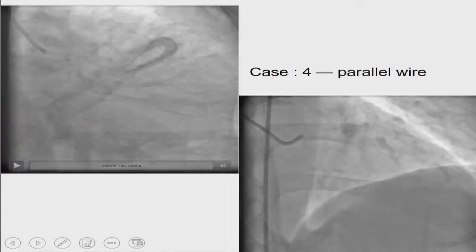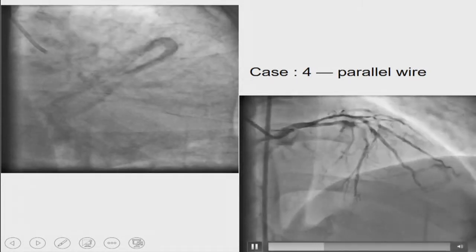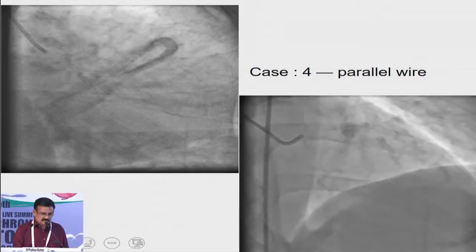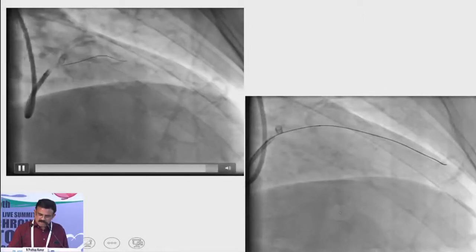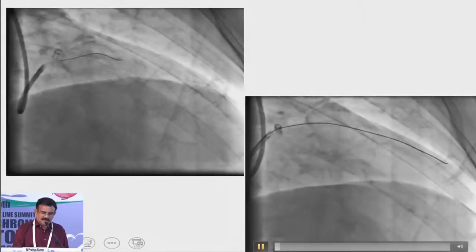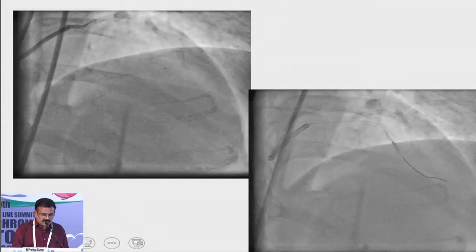Case 4, basically sometimes you have a lesion which is distal to that. You have a wire, a lesion, after that 2 branches coming up. You have a diagonal as well as an LAD coming up. We have taken a wire. The wire is crossing into the diagonal. I kept the wire, even the microcatheter is there. It has not crossed into the LAD. I just dilated into the track.